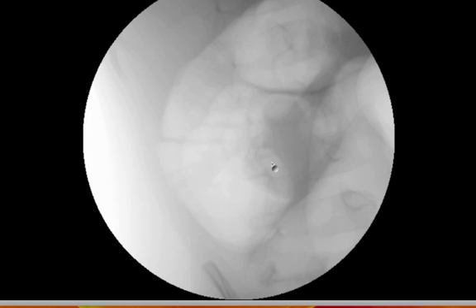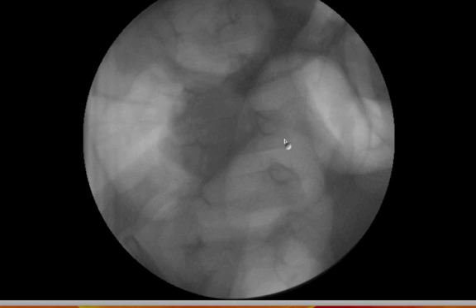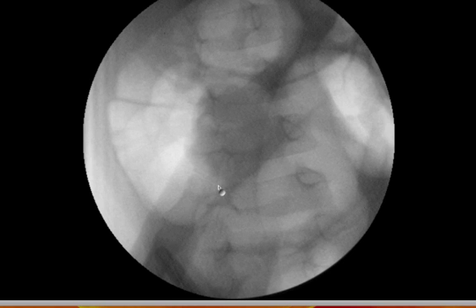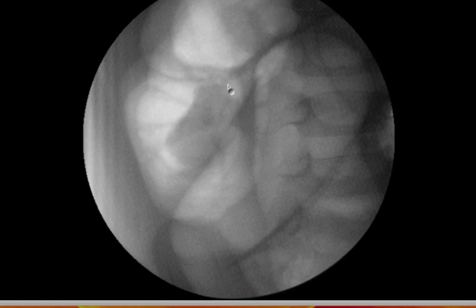This is a good view — you can see that filling defect protruding in. This is the entire area of distal bowel protruding into the colon. I'm trying, and time is going by. Here's the cecum again, here's that filling defect, here's the right colon. That filling defect is still present, and we're trying multiple times — inflating, deflating.